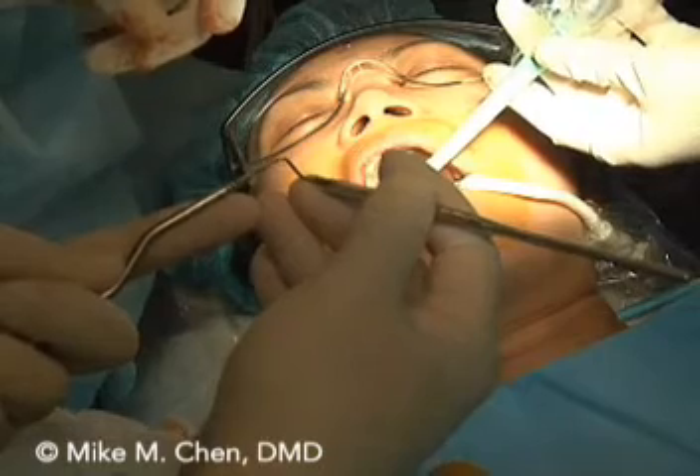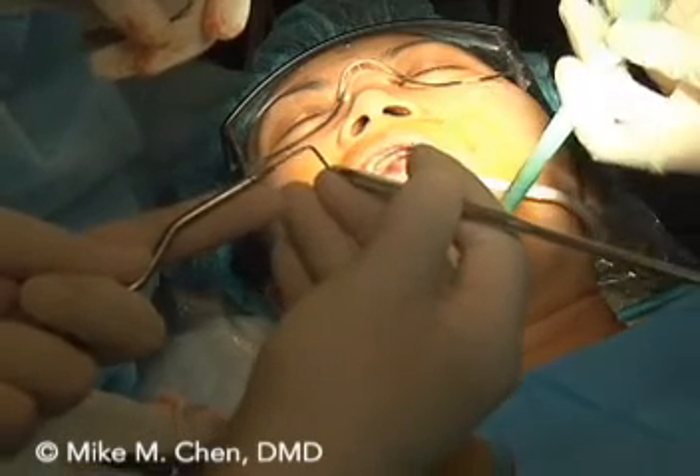You've got 6mm — it goes here at the second line. It's about 9mm.